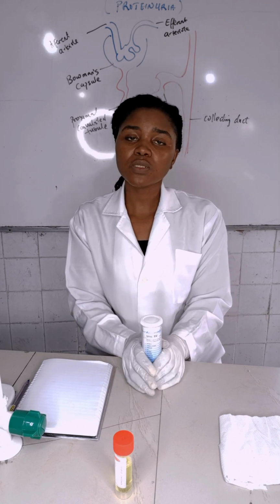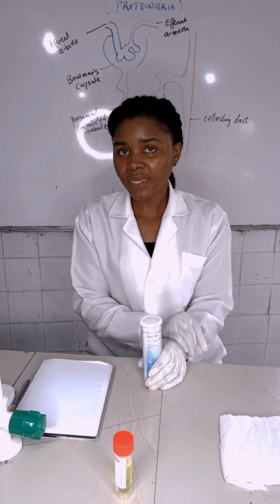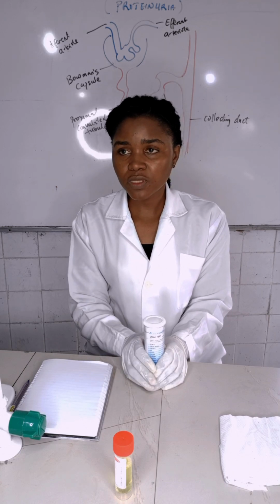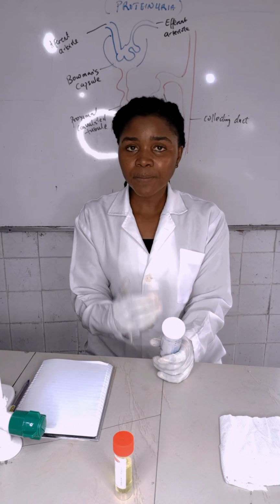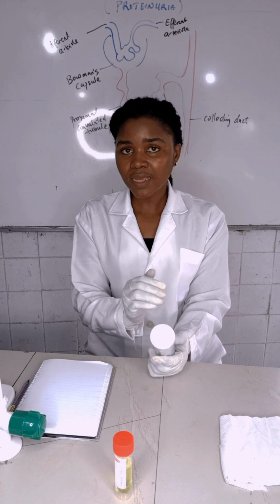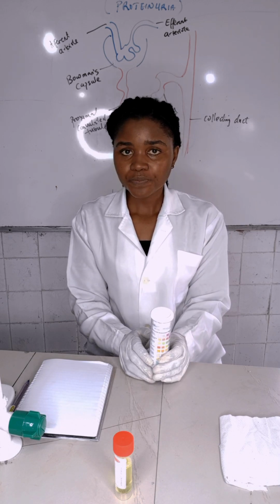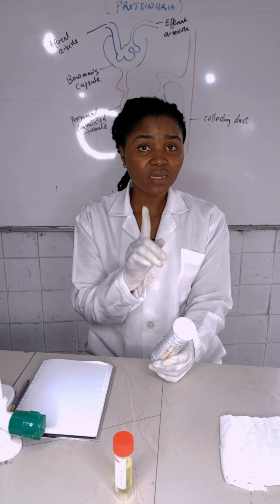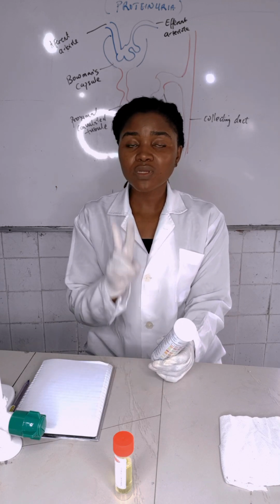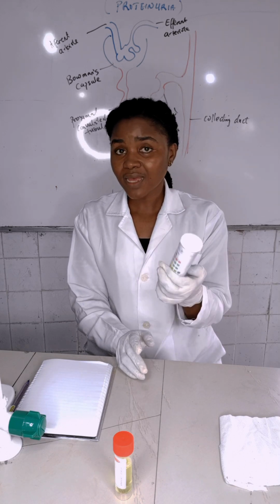A urinalysis strip simply consists of a plastic strip on which chemicals have been embedded. The first part of this lecture talked about the theoretical aspect of this, giving us a breakdown of the 9 parameters. This is Combi 9, and we call it Combi 9 because there are 9 different analytes that this particular strip can detect. There is Combi 2, there is Combi 1. The one that is just 1 is for glucose estimation. The one that is just 2 is glucose and protein. But this one has 9 parameters.